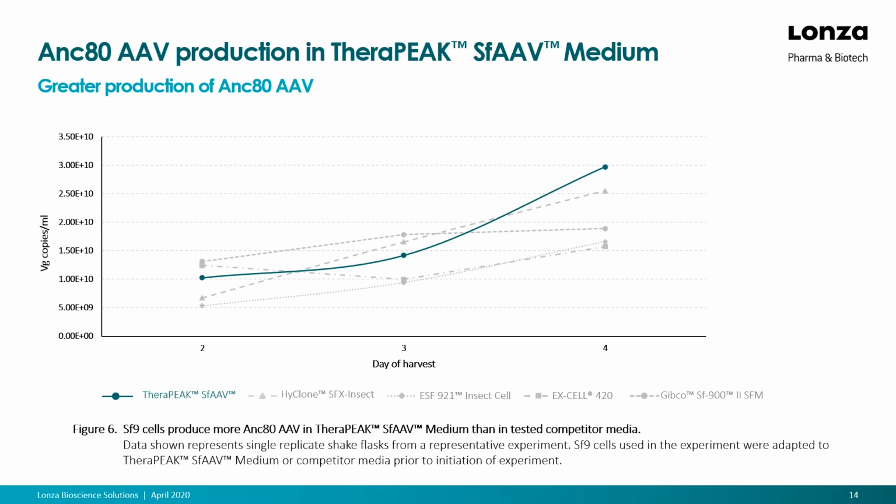In this experiment, we infected 4 million cells per ml with a multiplicity of infection, MOI, of 5 for both baculoviruses. After the infection, we let the cells produce viral particles for 2, 3, 4 days and harvested samples for titration.